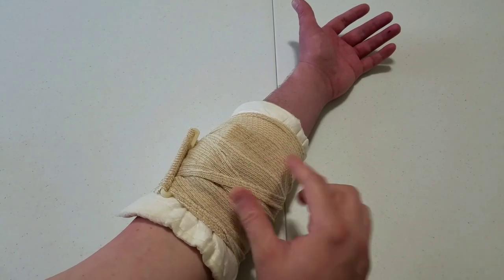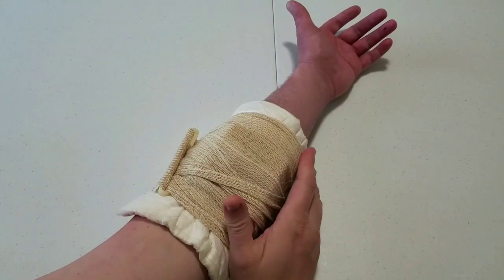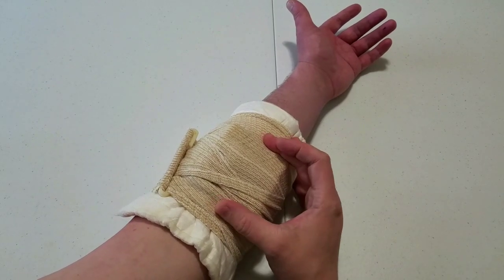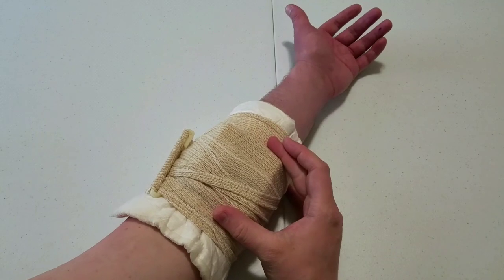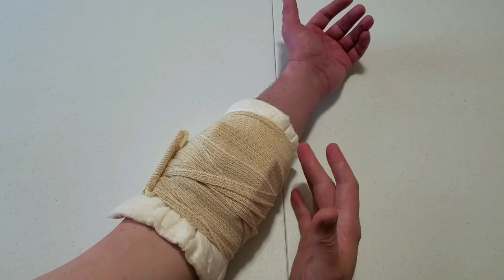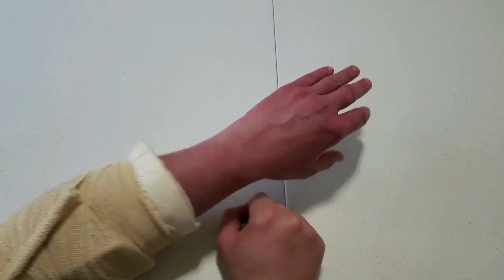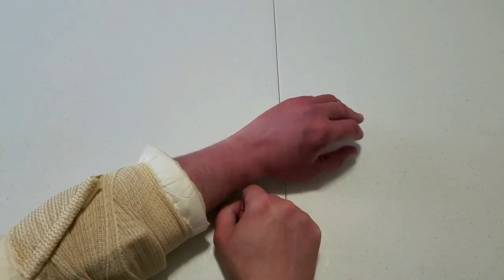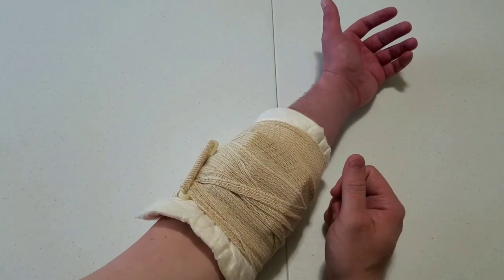It does apply a lot of pressure, but it only applies it where the H is. So although you have this huge pad, it's not applying pressure everywhere on that pad — only dead in the center, probably about a 2-inch square space right under that H. So you have a lot of pad but pressure only in a small spot. It is cutting my circulation off; you can see my veins popping out. You can really winch this thing down and apply a lot of pressure.